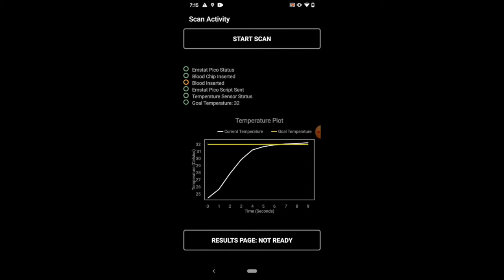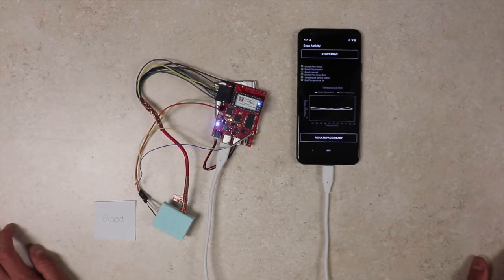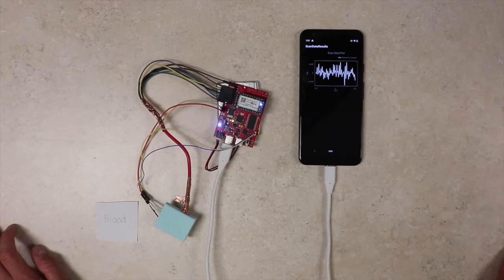Once the current temperature is within 0.3 degrees Celsius of the goal temperature for more than a couple seconds, this starts the EmStat Pico scanning process that's happening right now. Now the results are ready from the pico. We now click this button, and the results are now displayed on this screen. This data now feeds into Aptitude's coagulopathy measurement engine.